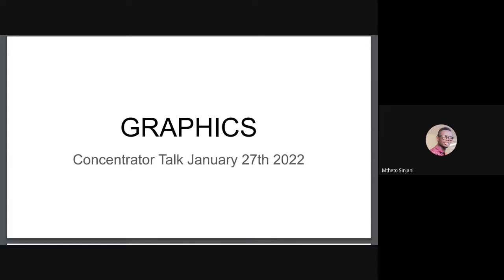In our experience, when using 13X in the DeVilbiss 525, the highest purity that we were able to achieve at a flow rate of 5 liters per minute was around 87%. So for this one, if it's possible, please find the lithium-based zeolite, which might solve the problem. Yeah, thank you.